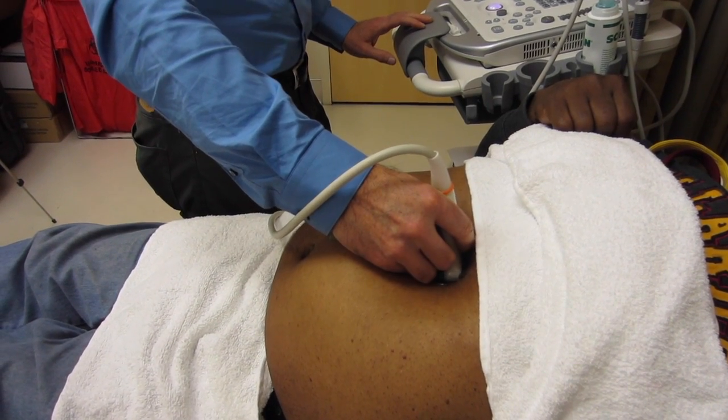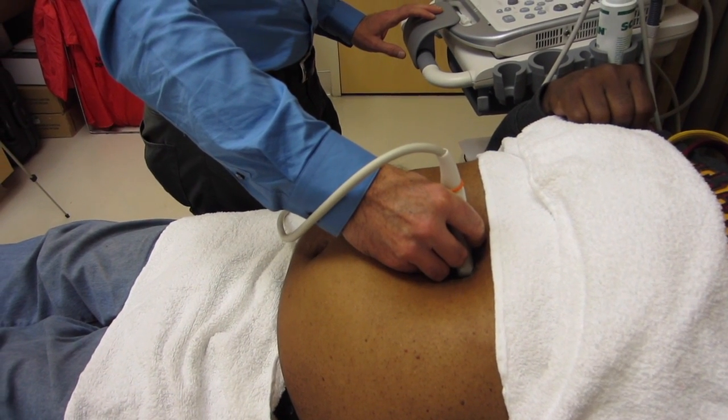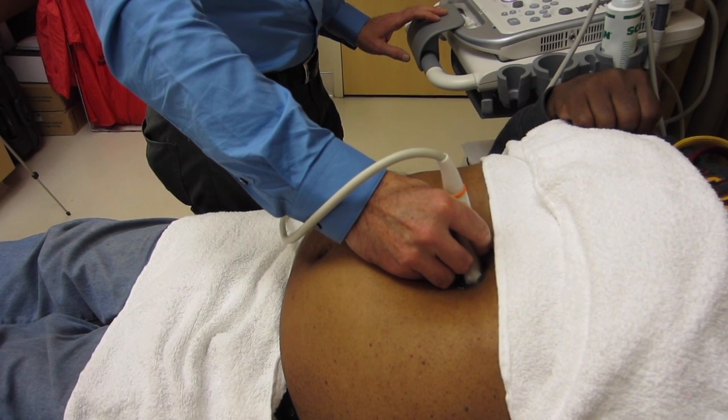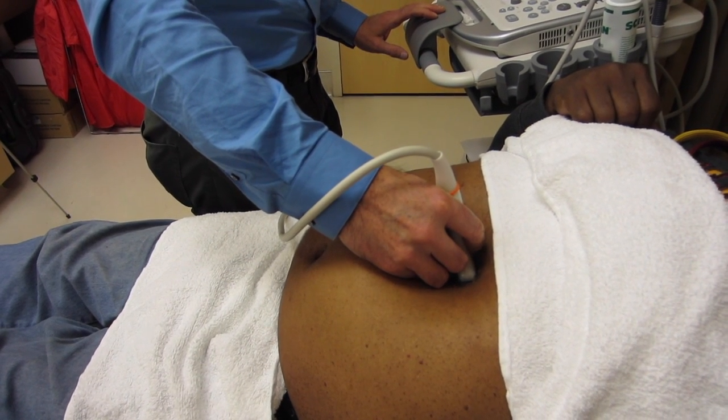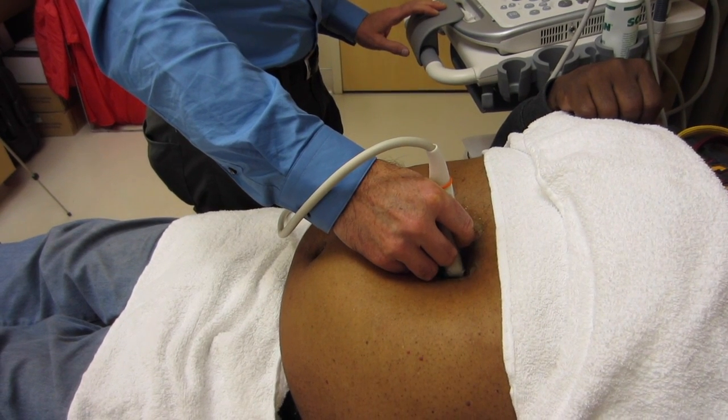Keep the probe perpendicular to the patient. Start just below the xiphoid process and gradually make your way down, visualizing the aorta the entire way.